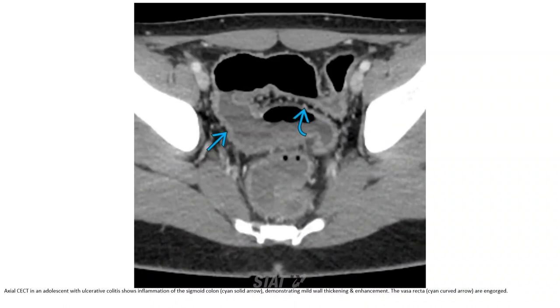Contrast CT enterography in an adolescent with inflammation of the sigmoid colon demonstrates thin, mild wall thickening and enhancement. The vasa recta are engorged.